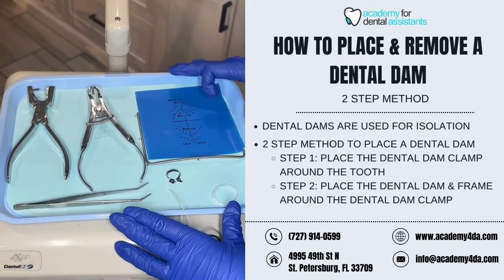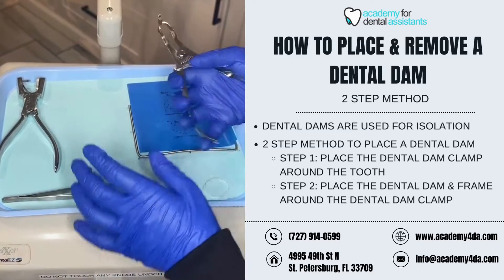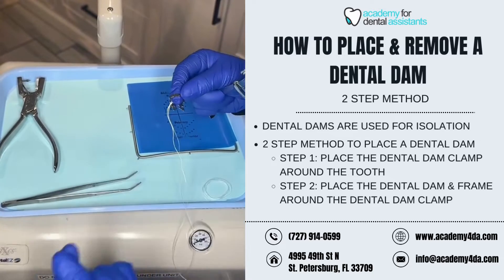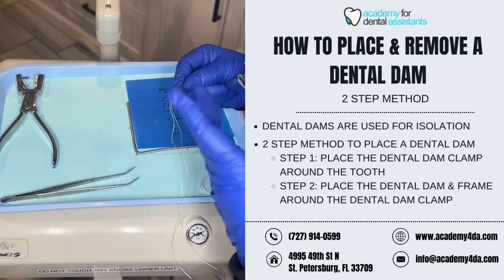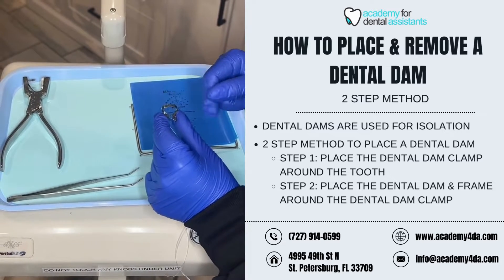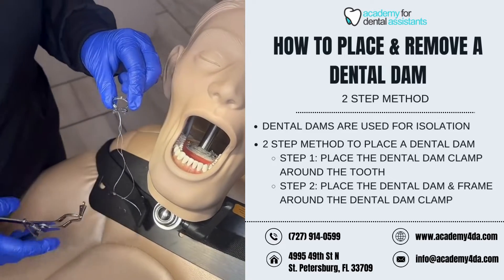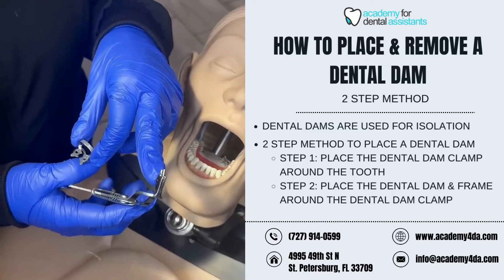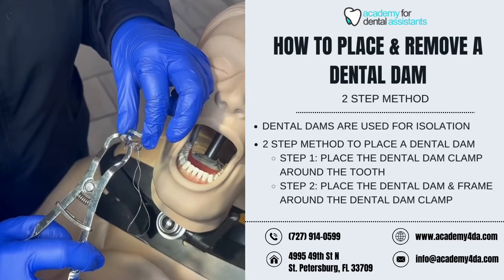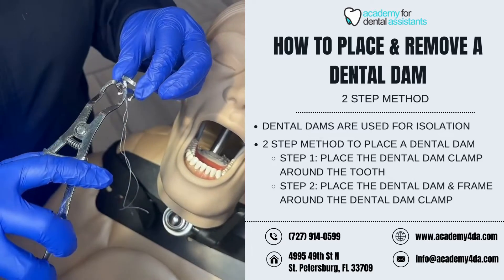In the two-step method, the first thing I'm going to do is grab my dental dam forceps and place my dental dam clamp on my tooth. In this example, I'm using tooth number 28, which is a premolar, so I have my premolar clamp here. I'm going to grab my forceps and stick the prongs or projections inside of the dental dam clamp itself.